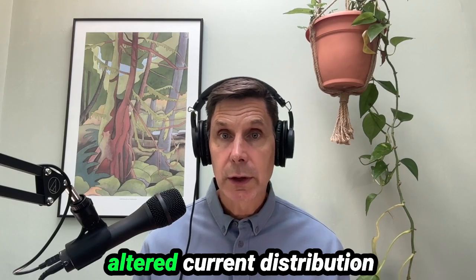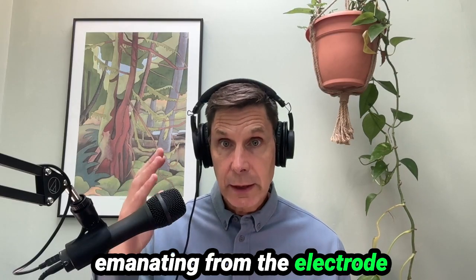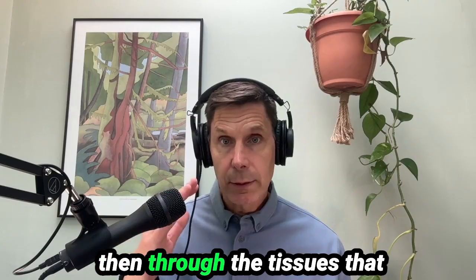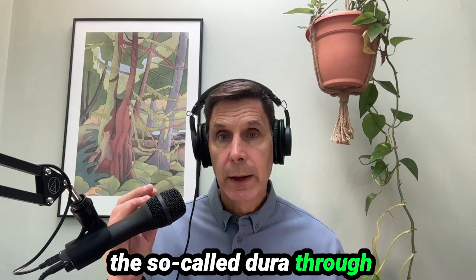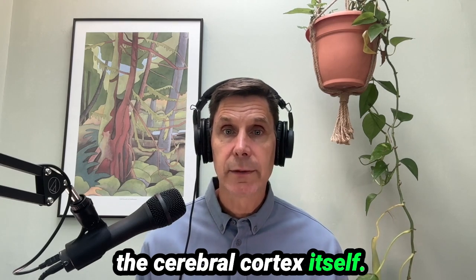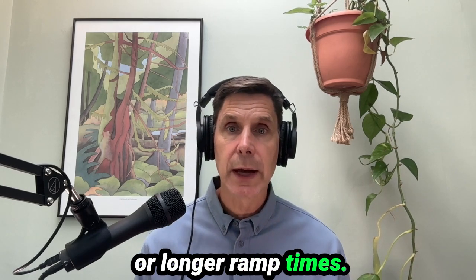That can lead to altered current distribution in terms of direct current emanating from the electrode on the outside of the scalp, traveling through the scalp, then through the tissues that are underneath the scalp, the so-called dura, through the CSF, and eventually to the cerebral cortex itself. This may require different electrode montages or longer ramp times.